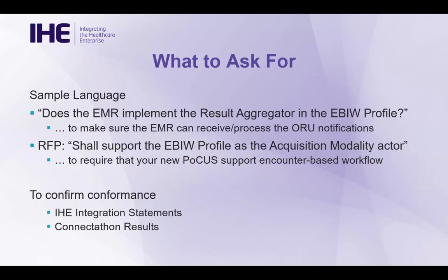This is an example for EBIW, but for IDAP, for CDS-OAT, for other profiles like IOCM or any other profiles in IHE Radiology, you can develop similar RFP-style language to make sure you ask the vendor what they support, including good context: what the use case is, how you want to use the profile to solve your problem, and ask for them in your RFP. And you can check the vendor's integration statement or the Connectathon results to see the level of support of these profiles or whether they are in the roadmap of their implementation.